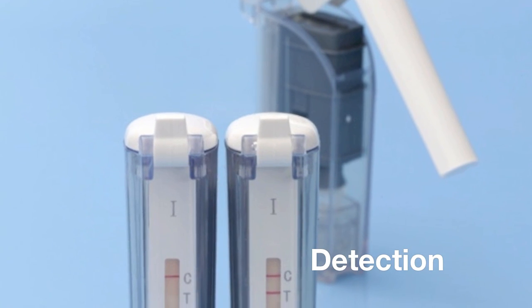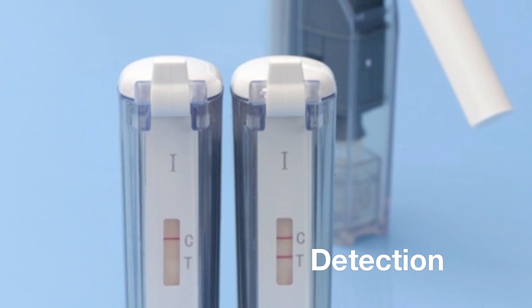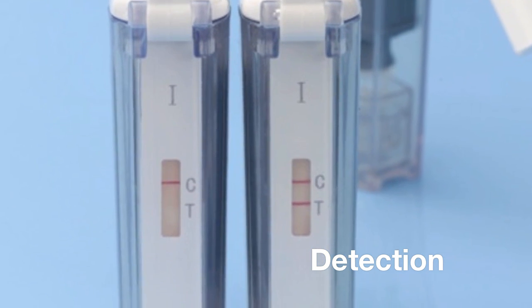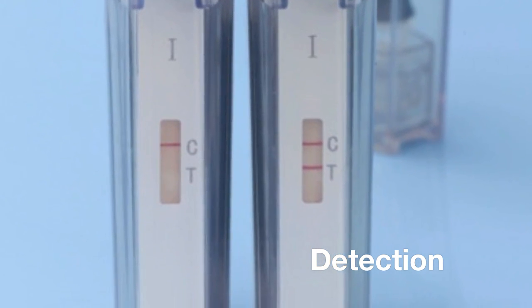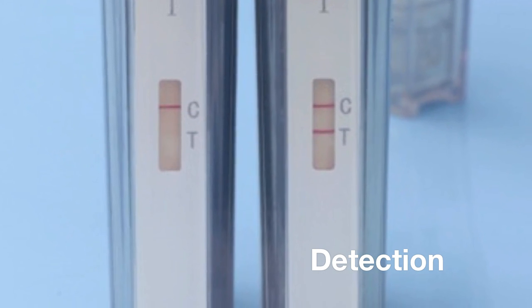After a one-hour incubation, a lateral flow strip embedded in a self-contained disposable cassette which prevents contamination allows colorimetric detection of the HSV target.